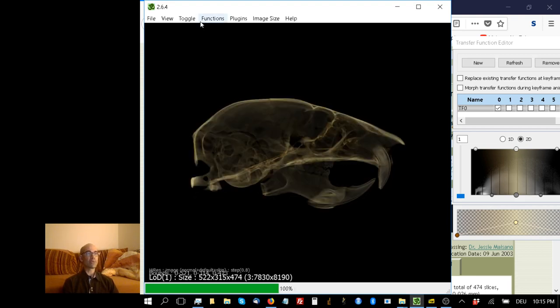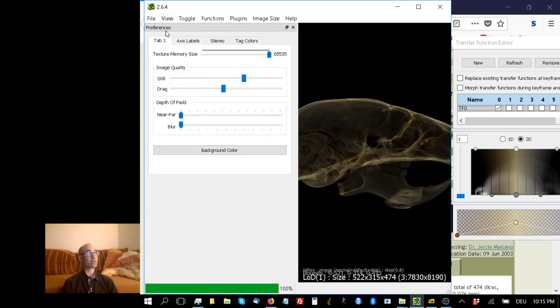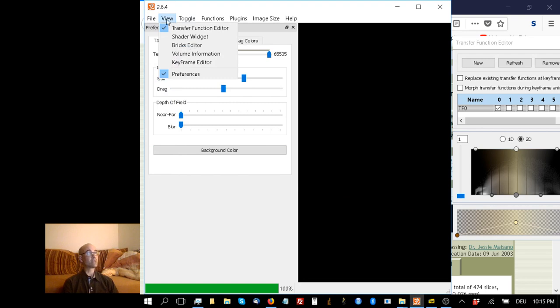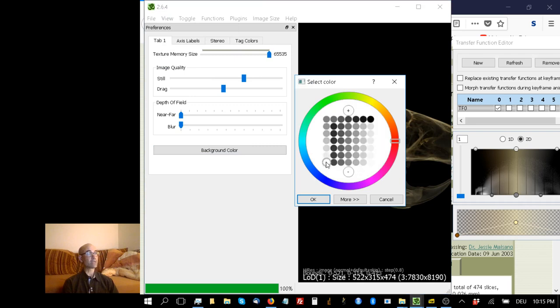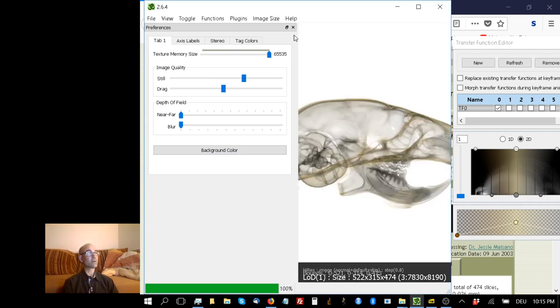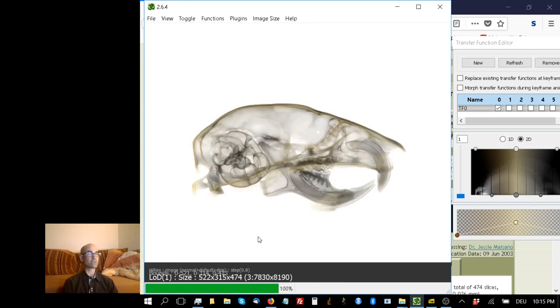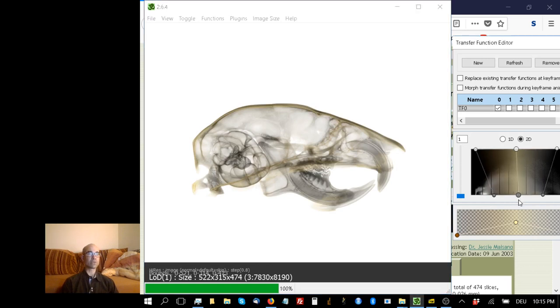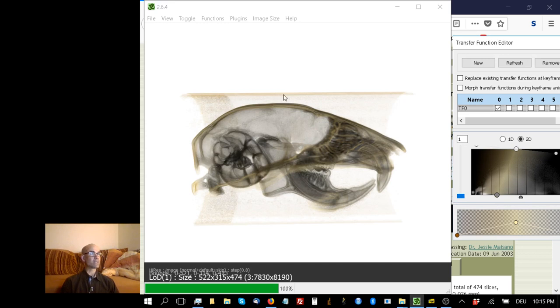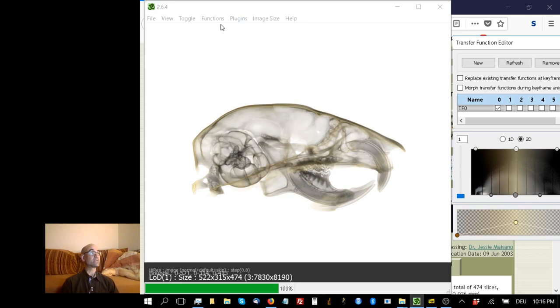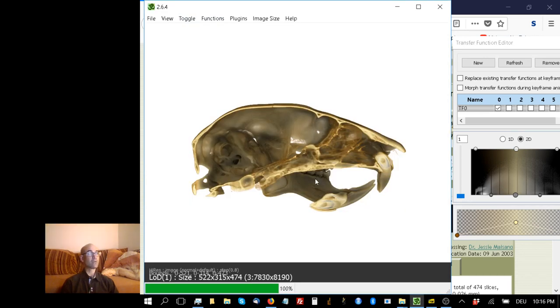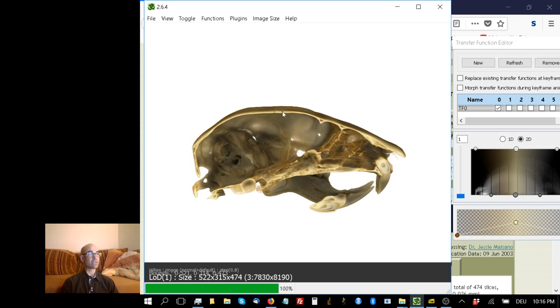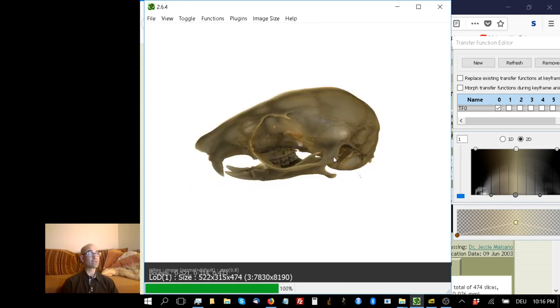We have some work to do because we can make this better. First, I personally prefer a white background to a black background. I go to View Preferences, click on background color, and select white. It's a little better, but the bone is still quite translucent. Another option is to go under Toggle and untick skip empty regions. That's much better - it's rendering more of the voxels that I want it to. That bone is a little more opaque. We can see sutures, roots of teeth, all sorts of anatomical goodies.